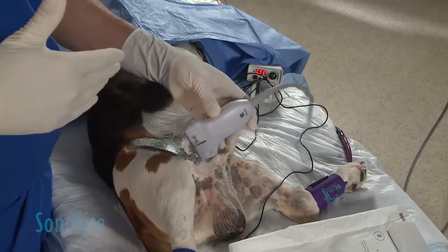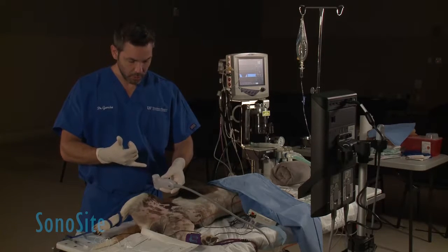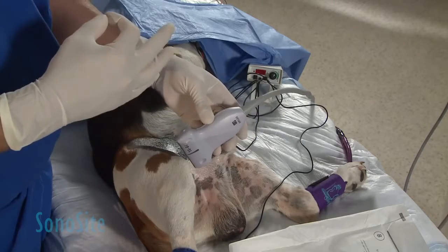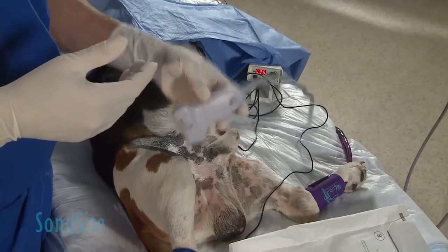I'm going to do a scout, and notice that I'm using the position of the probe in the same direction that I'm going to be injecting and penetrating with my needle, so it makes it easier for me intuitively to inject and watch in the same direction.